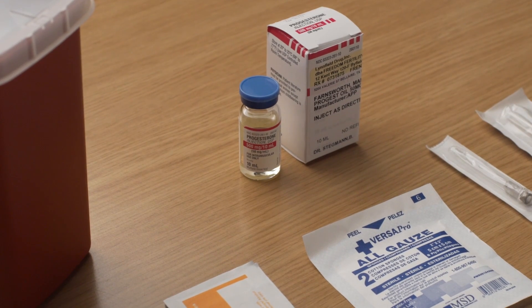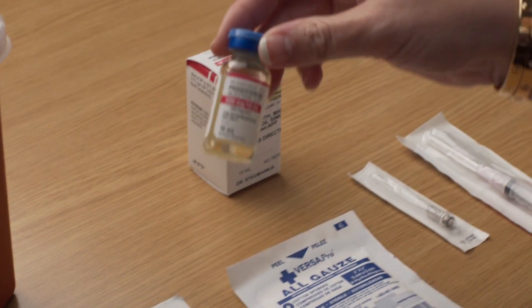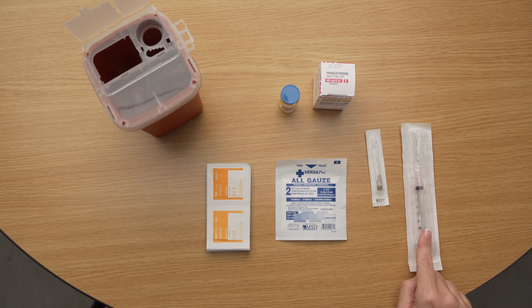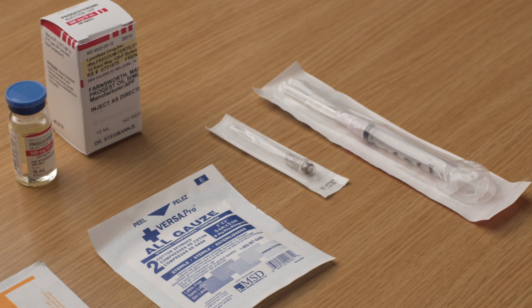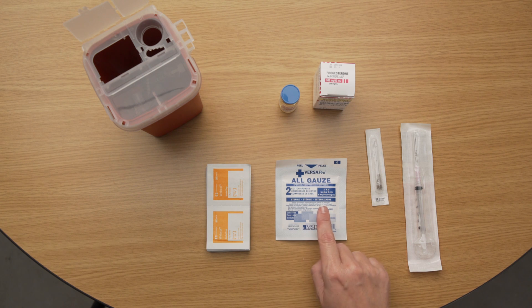Before you begin, be sure to have all of the following items: one multi-dose vial of progesterone in oil, 10 milliliters or 10 cc's; one syringe; one long thin needle for injection, usually 22 gauge, one and a half inch; one needle for drawing up the medication, usually 18 gauge or one and a half inches; alcohol swabs; sterile gauze; and a safety container.